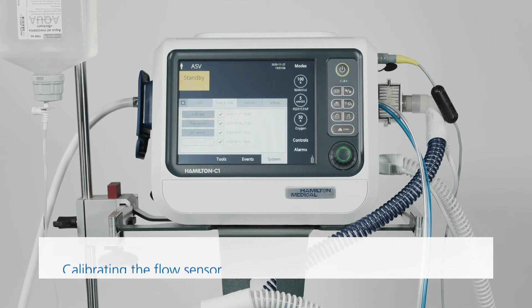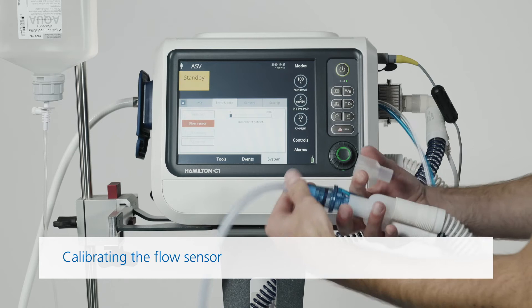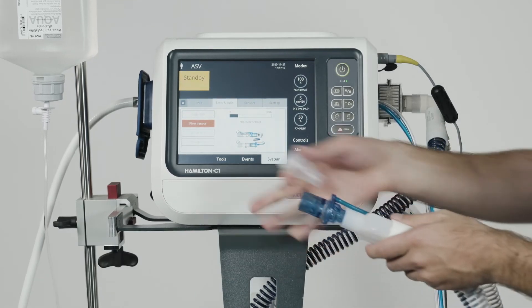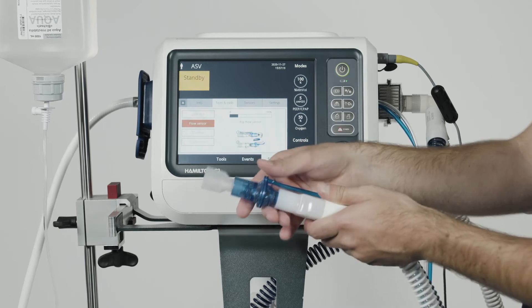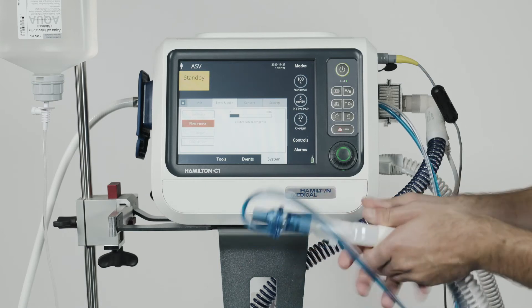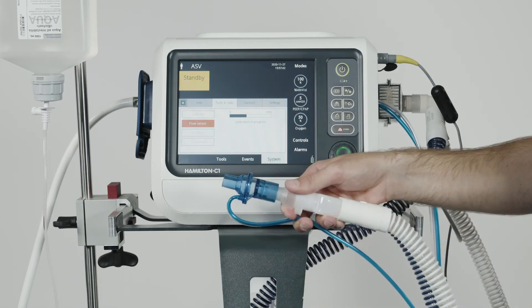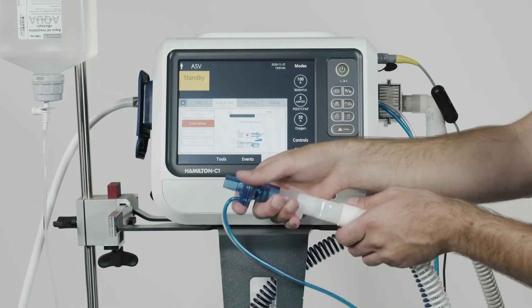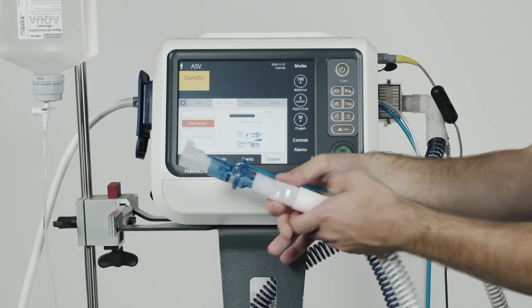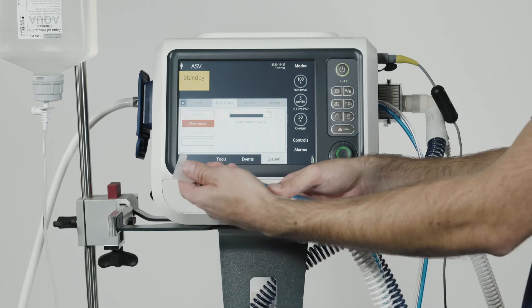To calibrate the flow sensor, choose this function. When the message saying 'Disconnect Patient' appears, you should disconnect the test lung and then attach the adapter to the flow sensor. When you see the message 'Flip the flow sensor', flip the flow sensor around. Then wait. And flip the flow sensor back to its starting position again. Once you've done that, you can disconnect the adapter from the flow sensor.